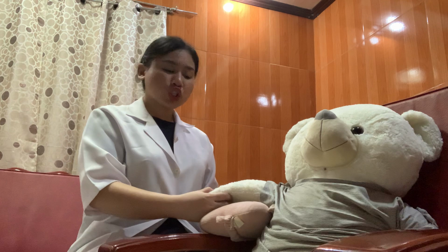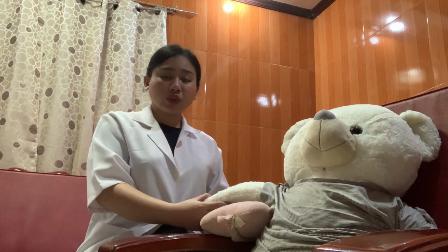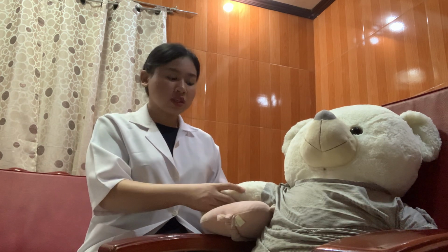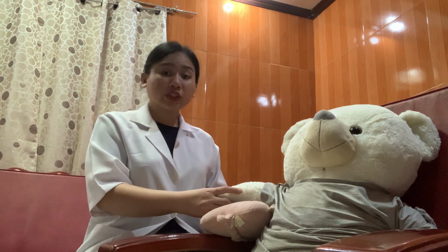Dorsiflexion of the wrist moves the artery closer to the skin surface, making the artery easier to palpate.